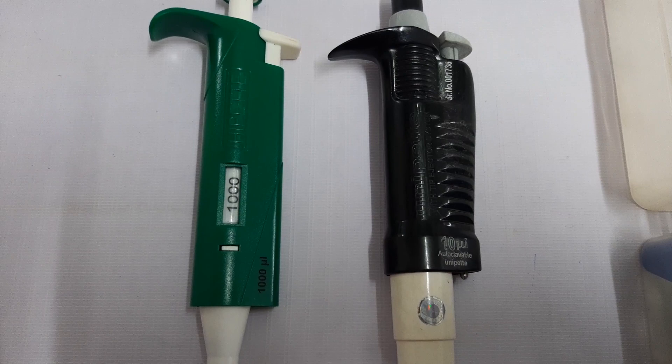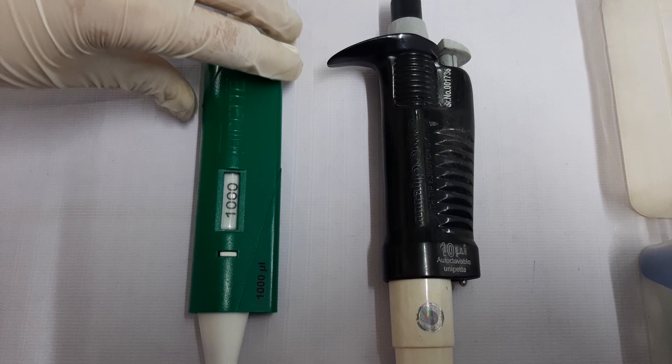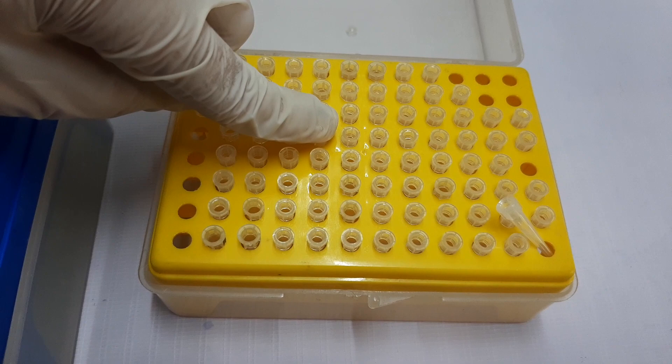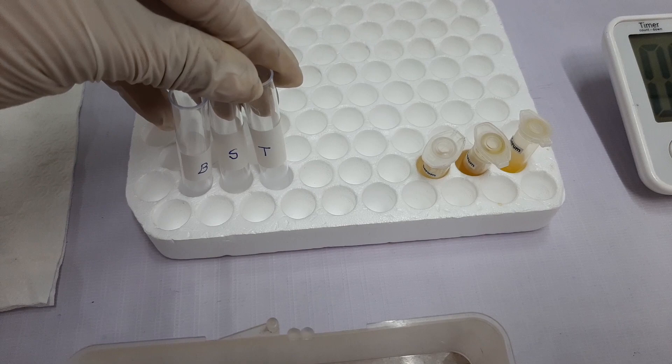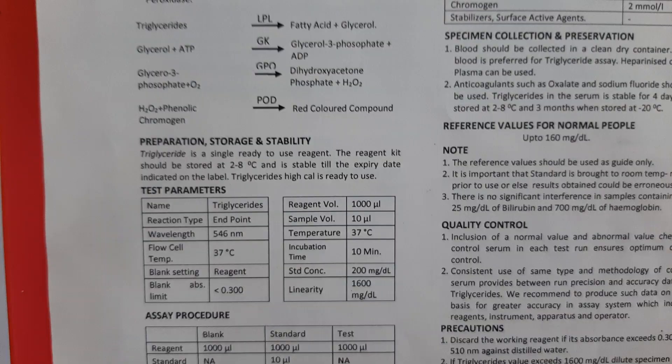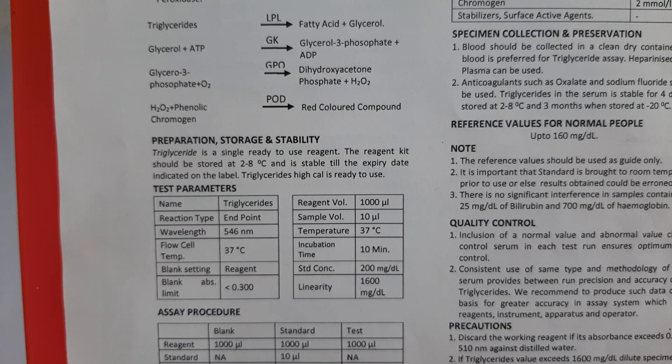Apart from this, you may require additional items such as a clean and well-calibrated pipette of 1000 µL volume, a clean and well-calibrated pipette of 10 µL volume, clean and dry tips of 1000 µL volume, clean and dry tips of 10 µL volume, tissue paper, clean and dry tubes in which the test is to be performed, patient sample, and a timer or stopwatch.